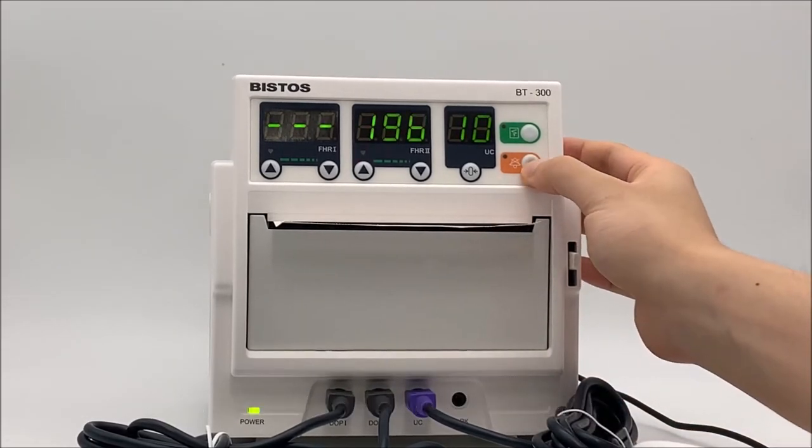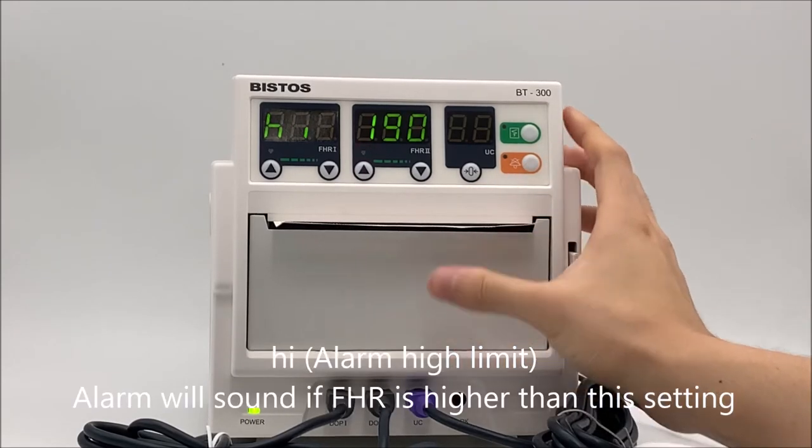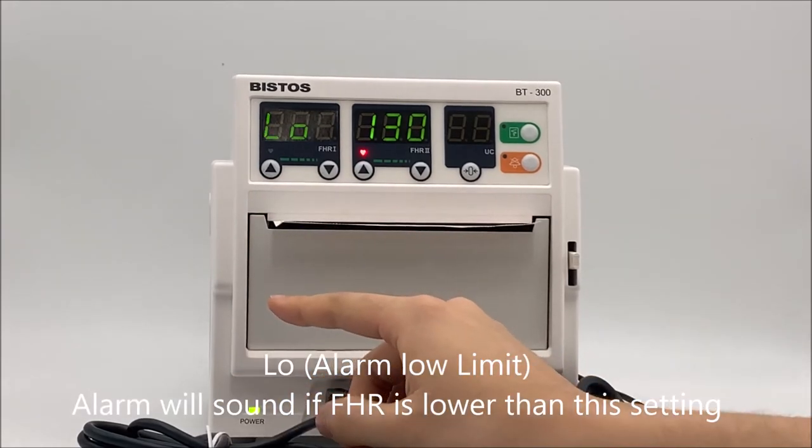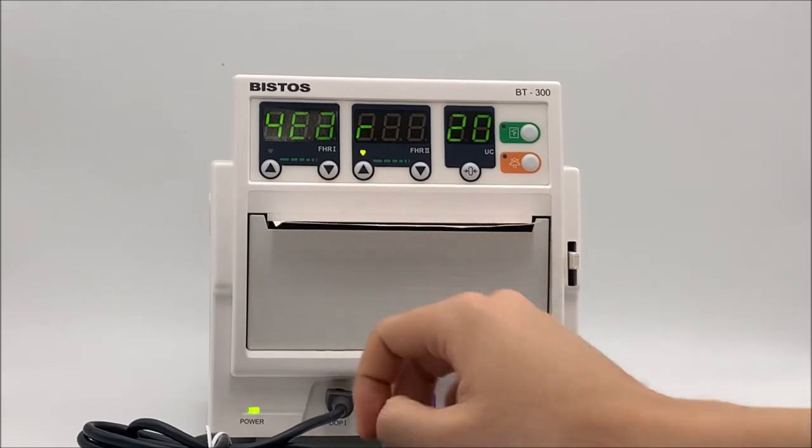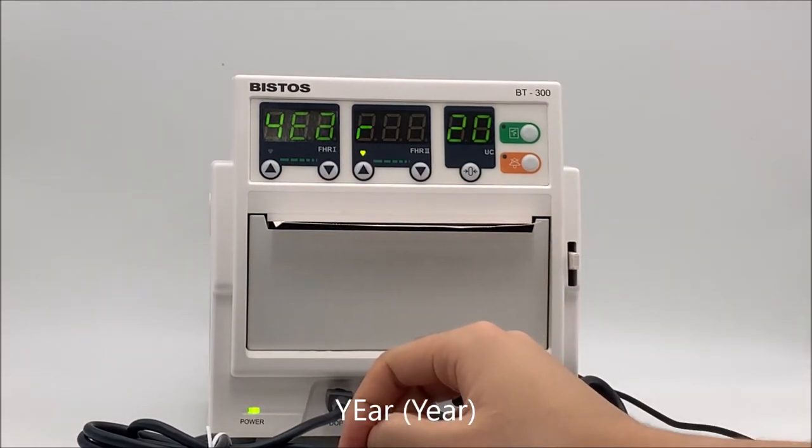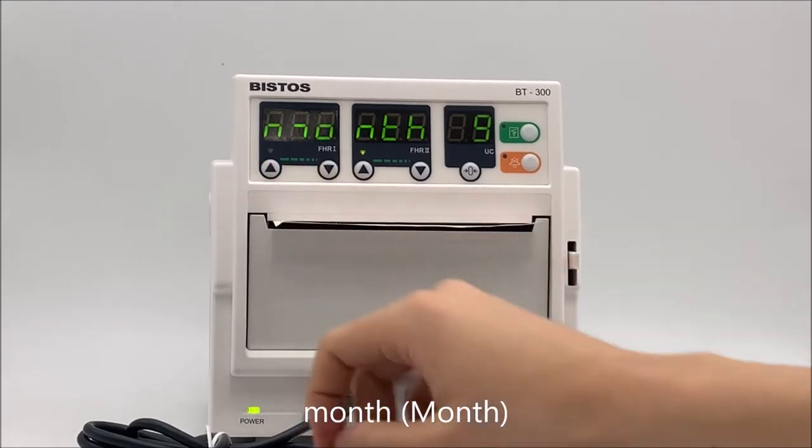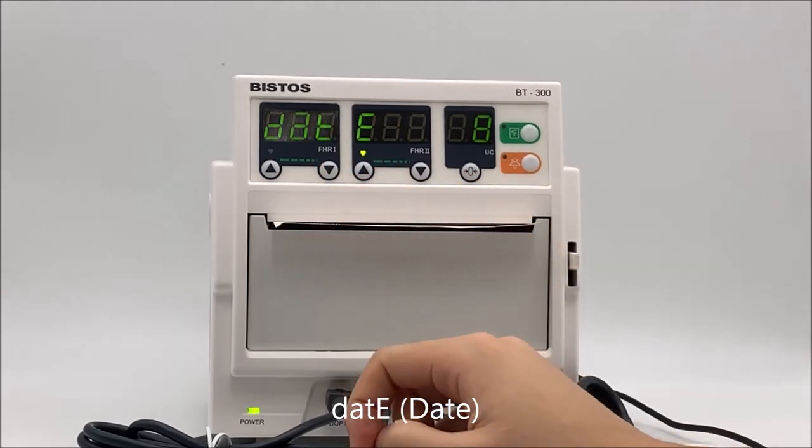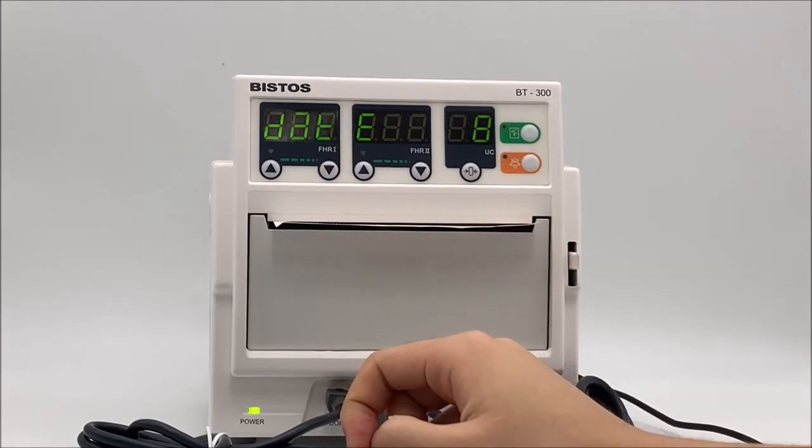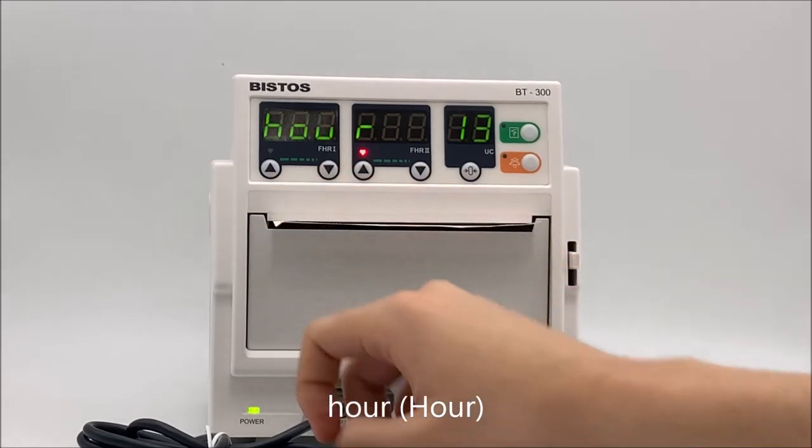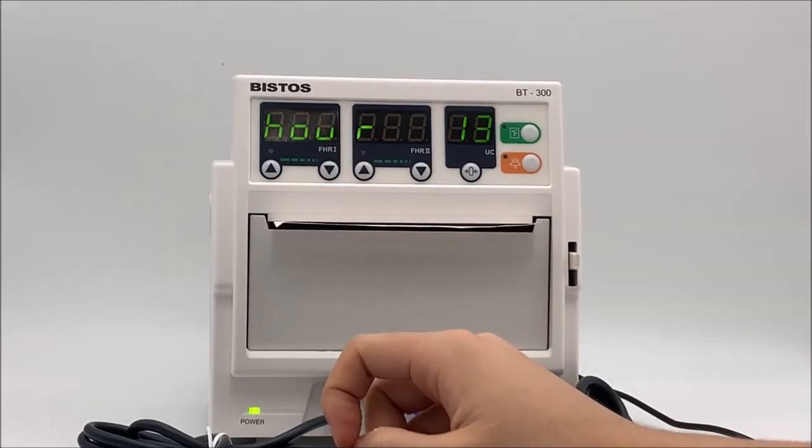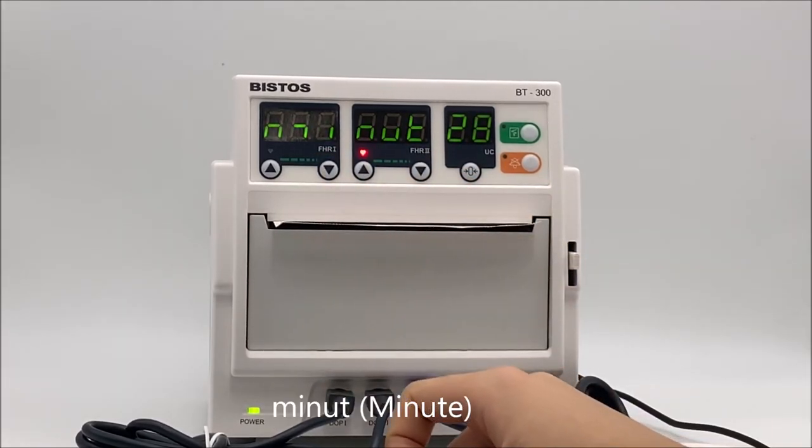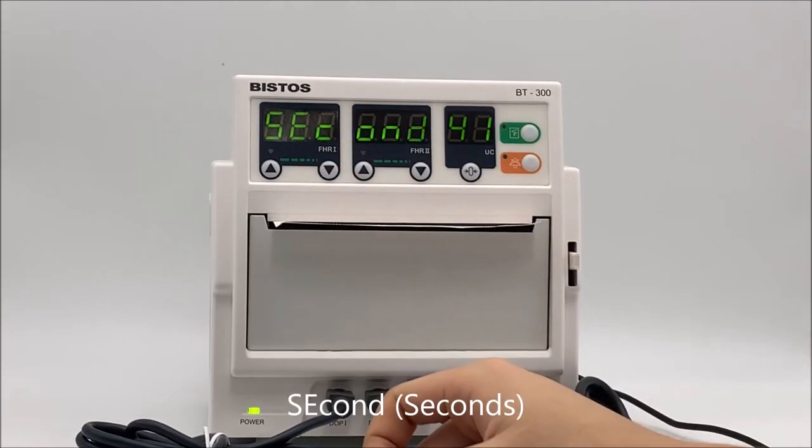Alarm and clock setup. Alarm high limit. Alarm low limit. Alarm will sound if FHR is lower than this setting. Year. Month. Date. Hour. Minute. Seconds.